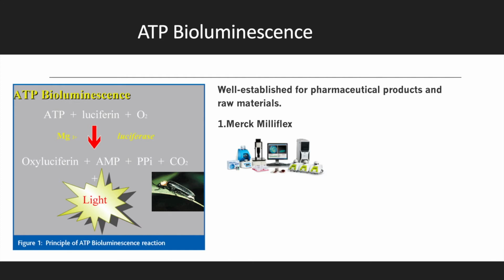This machine involves sample filtration. The filter contents are then placed onto agar, and then ATP releasing agents are added before the luciferin and luciferase treatment. A cell count is then reported, and there is an option for a longer growth stage, which is helpful because then you can have subsequent identification of your organism.